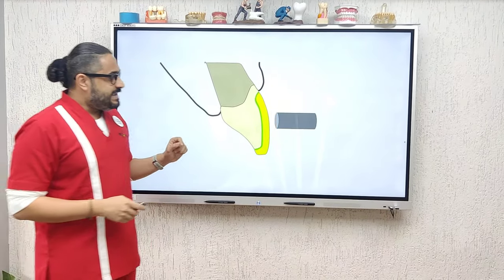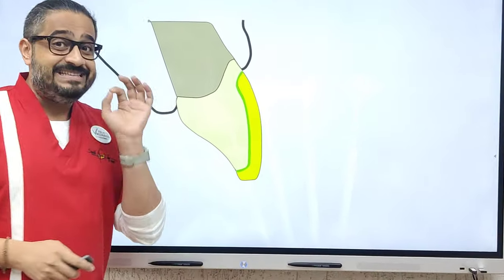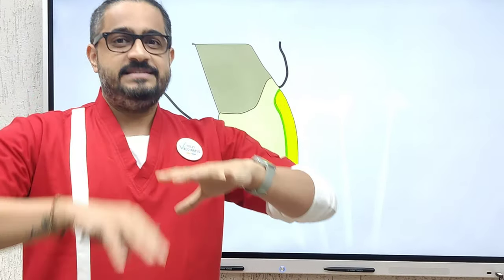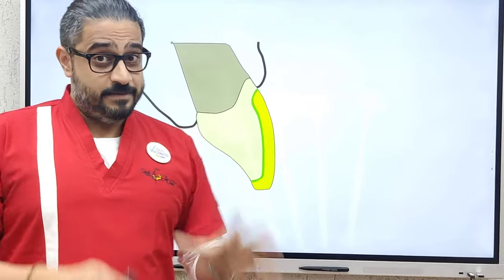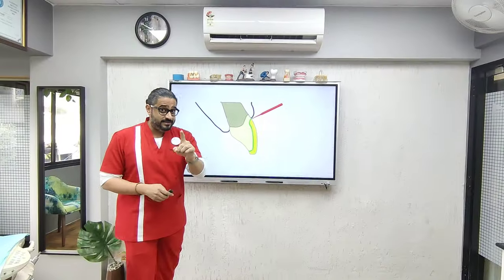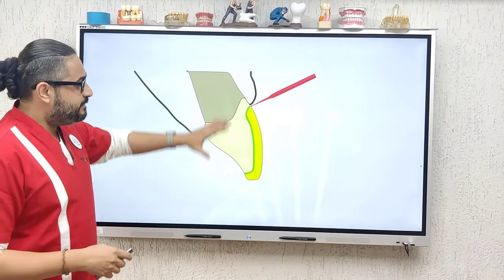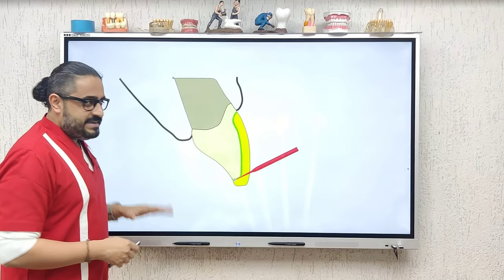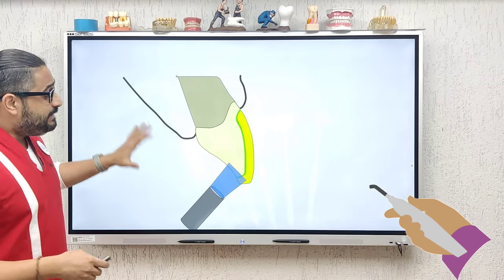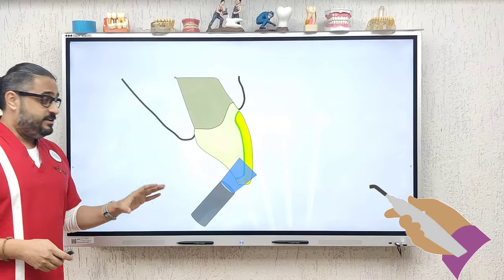Now take your light cure gun and tack cure for one second only — flash on, flash off. This allows the excess cement to become semi-solid. Take a fresh applicator tip — not the one you applied bonding agent with — and clean all the excess out. Floss the contacts, and once everything is clean, go ahead and thoroughly light cure.